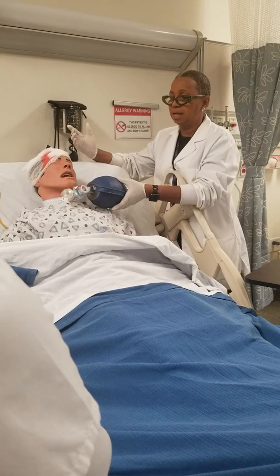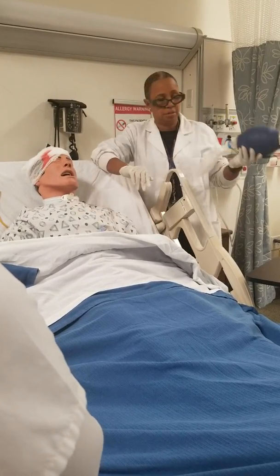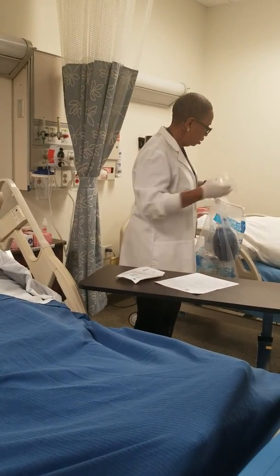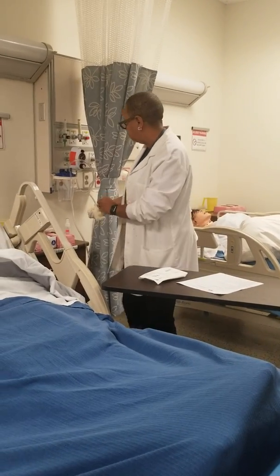So I see that his numbers have come up. He looks a little bit better. I then have to give him a chance to catch his breath, because like I said, every time you do something to someone with a trach, they're going to cough. So at that point, I'm watching him, seeing how he's doing, and I'm setting up.